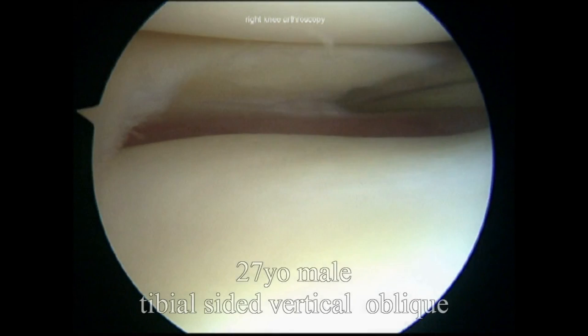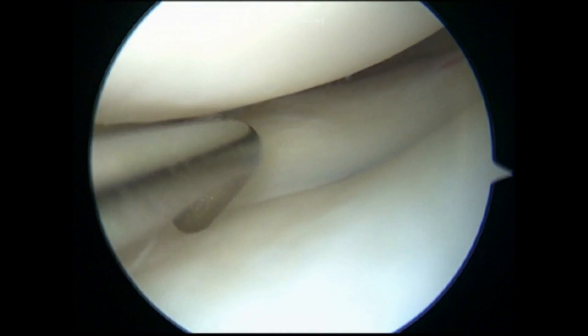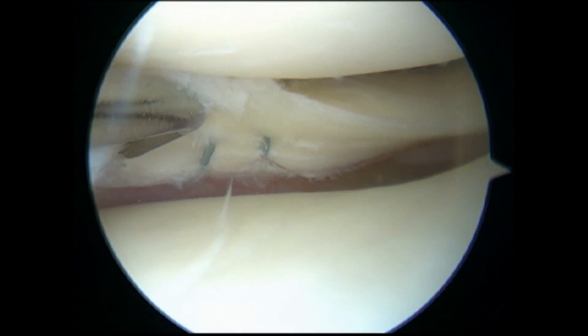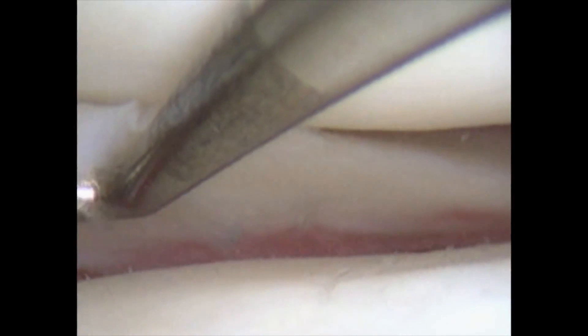The first case is a 27-year-old male with a tibial-sided vertical tear at the level of the popliteal hiatus in conjunction with an ACL reconstruction. Two circumferential compression stitches were placed around the tear and tied down on the femoral side. The patient developed a cyclops lesion at eight months post-op and an arthroscopy was conducted, which revealed, as expected, that the sutures had synovialized, the knots had been embedded into the meniscus, and the tear had healed. Notice that the meniscus is sitting nicely within the joint and it's not extruded or trapped in any way.